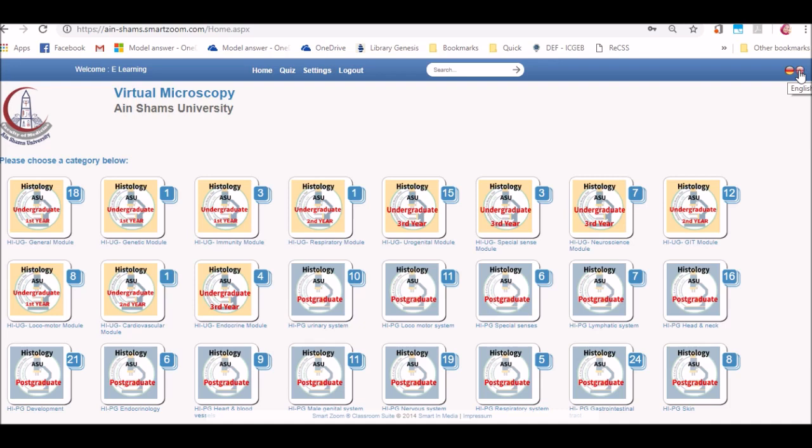As you can see on the top right, you will find two flags. One for the German language and one for the English language. If you have appearing German language, then please click on the English language flag.